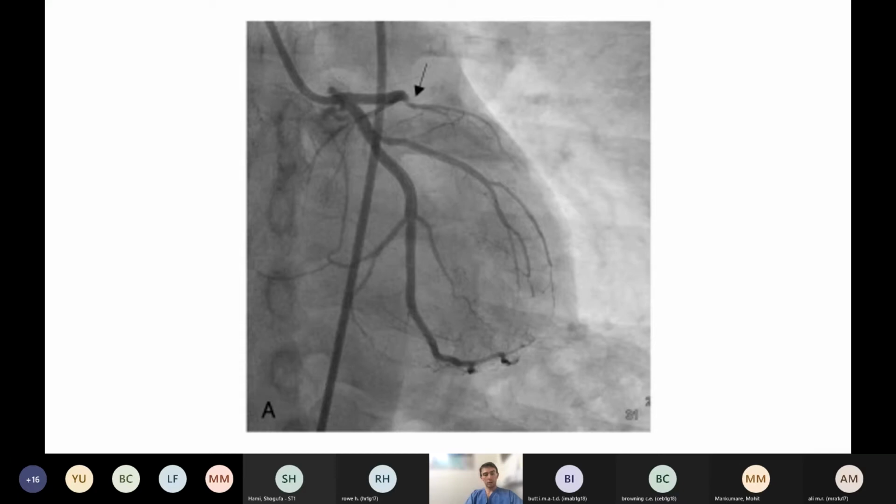What you do is you thread a catheter, a very, very thin straw, all the way around the aorta and right to the start of the coronary ostia, and dye is flushed down there. In this case, we are looking at the left coronary arteries. If you can see my arrow key, the catheter has entered the left main stem, which in this case is quite short, and dye has been flushed down here.